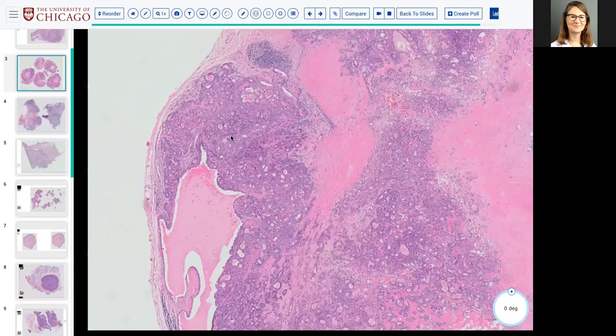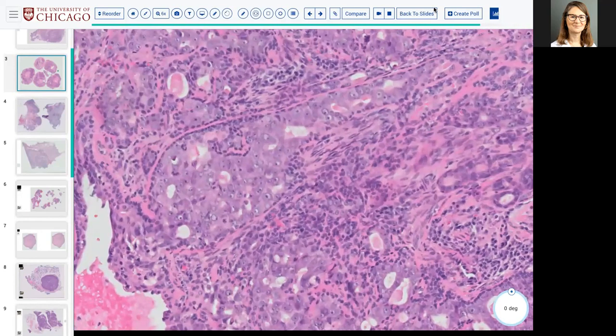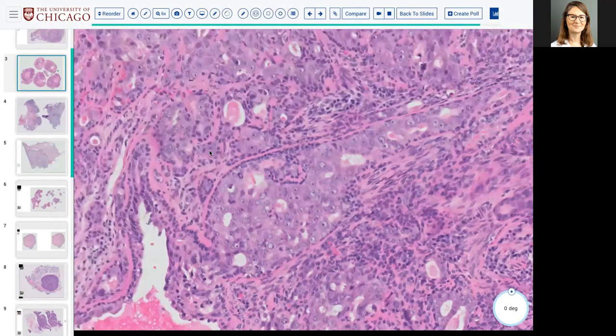So what are the invasive carcinomas that have two cell types? First of all, what are our options? Epithelial-myoepithelial carcinoma, and adenoid cystic. Exactly. So do these look like either epithelial-myoepithelial or adenoid cystic necessarily?